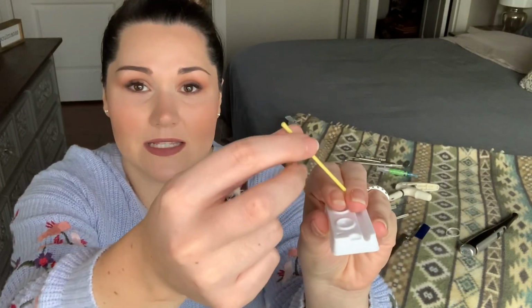So then, once you fill up your little Dappen dish, I always hand it to my doctor like this with the little micro brush in the hole that has the bond. And then he grabs this like so. He might dab it a few more times, and then he's going to put it on the tooth or on the part that's getting the filling.